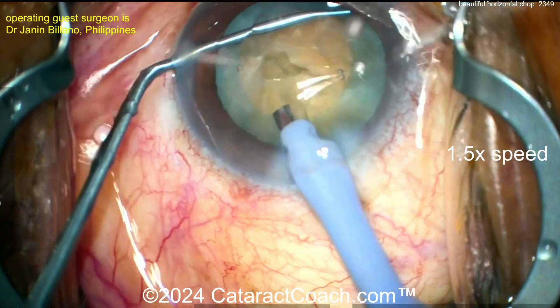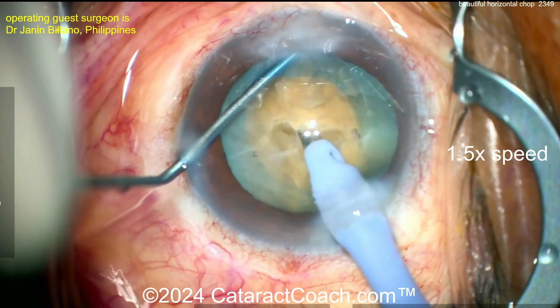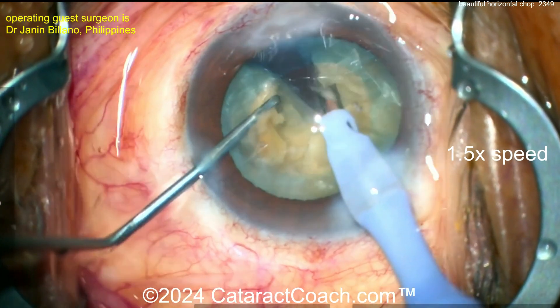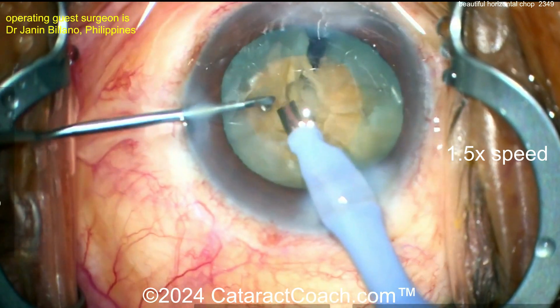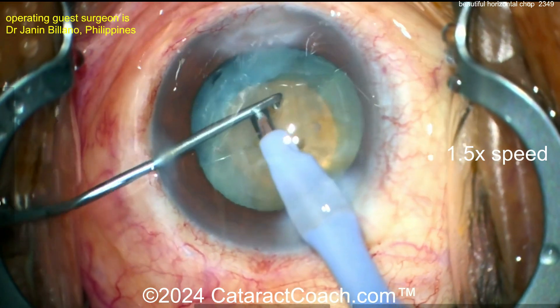Let's go to chop around again — pre-placement of the chopper around the lens equator — then buzz into the FACO probe and you get that high vacuum chop right there. Look at that! I like that separation you did there at the end — pull the pieces apart. I like that maneuver, that's helpful. That really helps to separate the pieces.